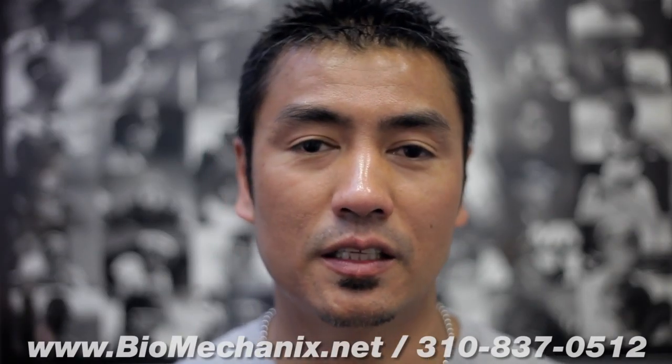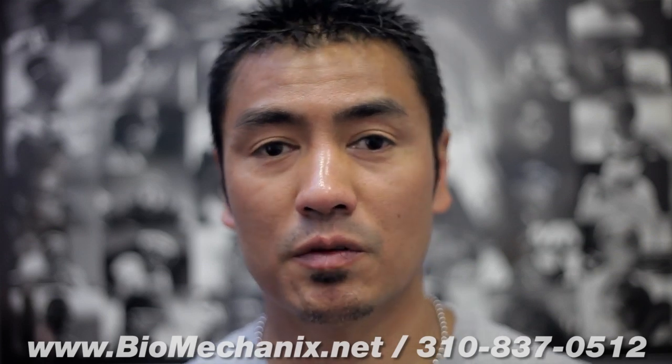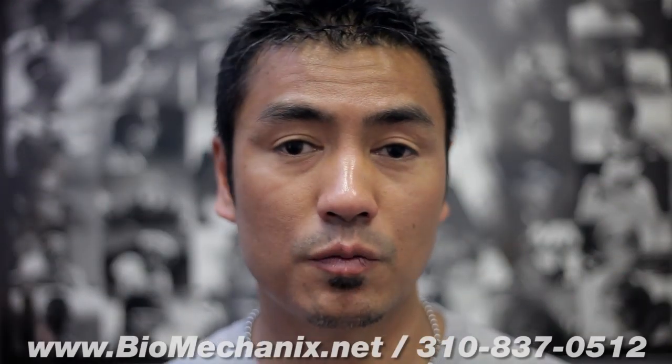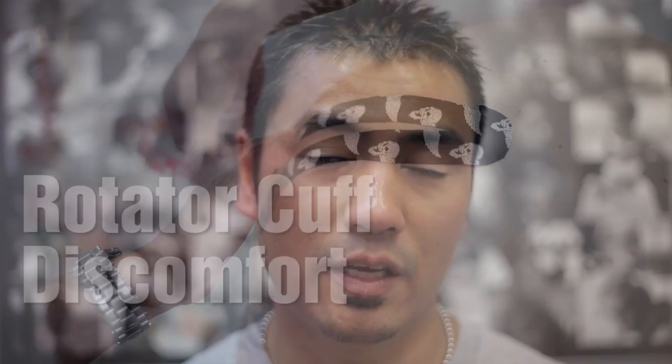This is John Torre from Biomechanics LA. In today's video we're going to do three different types of kinesiology taping for the shoulder. The first one is for an AC complex impingement syndrome, or acromioclavicular impingement. The second is a scapular stability taping, which I like to do in conjunction with the AC impingement taping. The last one is a rotator cuff discomfort taping. We're going to do all three in one video.